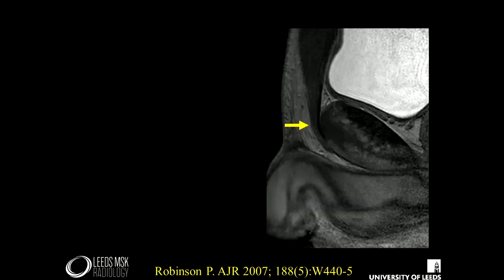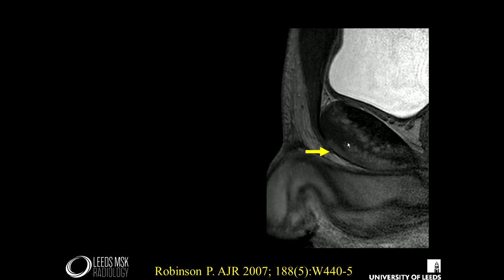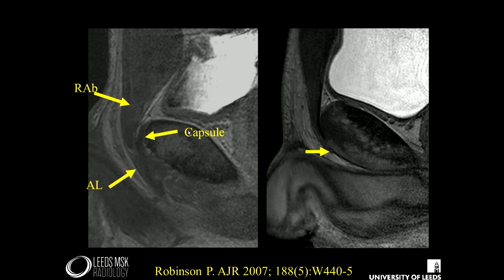This complex merging of tissues can be seen on MRI. This is a high-resolution sagittal image at the level of the symphysis pubis disc. Here is the disc, the bladder, and rectus abdominis and pyramidalis. You can see the tendon doesn't insert into the top of the bone — it wraps around the front of the disc and the capsule. Moving to a slightly more lateral position, this is the body of the pubis proper, with marrow signal here and the capsule anteriorly blending with rectus abdominis and adductor longus. This junctional area of soft tissues with the capsule is important in both acute and chronic injury.